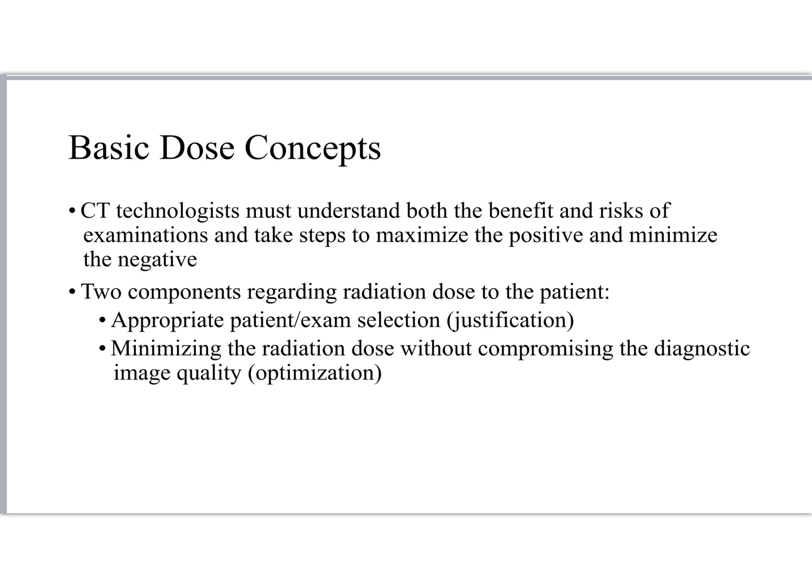So it's helpful just to start with the absolute basics of dose concepts, and that is where Lois Romans begins this chapter. And if I remember right, I may have been a first reader on this. I wasn't an editor of this textbook chapter, but I believe I did do a first read of it. So we need to understand both the benefits and risks of examinations, and what we want to do is take steps to maximize the positive and minimize the negative.